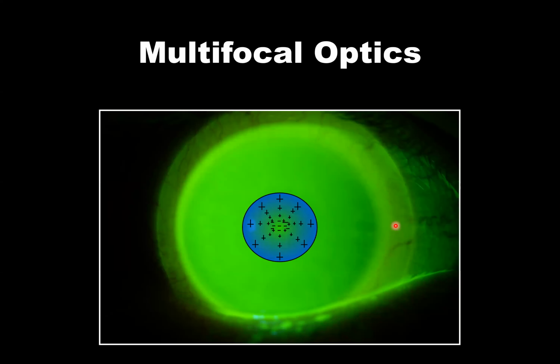You can also fit a multifocal smart lens where the center has the most minus for the distance, the near toward the outside. The lens can be built so that the powers within the pupil can be provided specific for each patient.